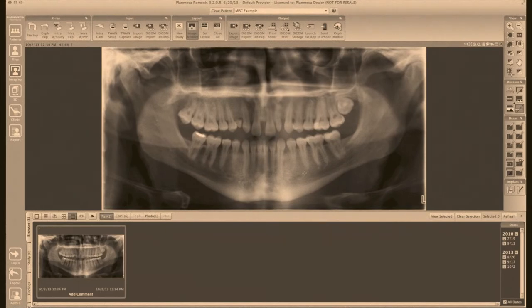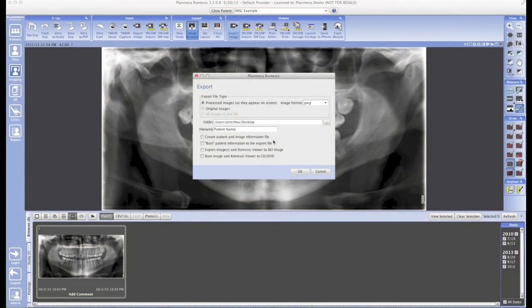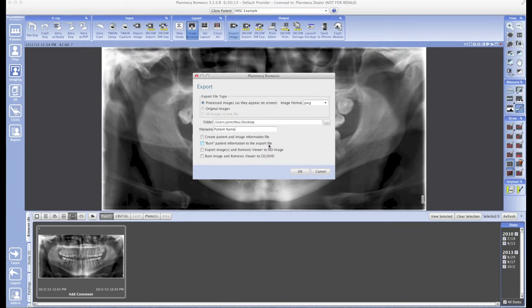The first option we see says Create Patient and Image Information File. This literally just creates a text file that includes image-related information. The next box says Burn Patient Information to the Exported File. This attaches the image information directly to the exported image. The next checkbox says Export Images and Romexis Viewer to an ISO Image. This creates a special file that your computer can use to burn things to a disk without the need for the Romexis viewer.